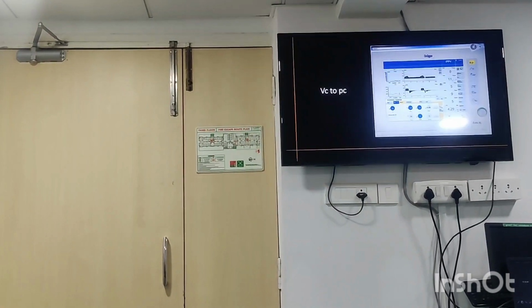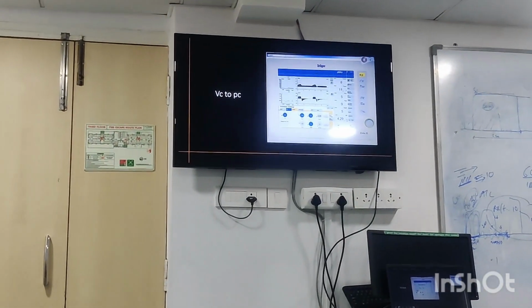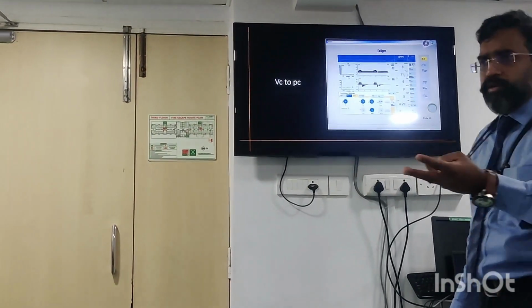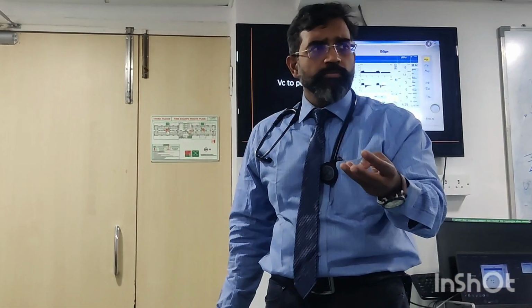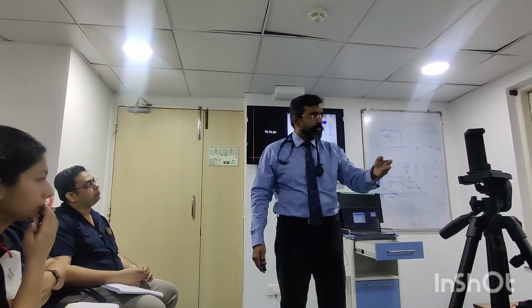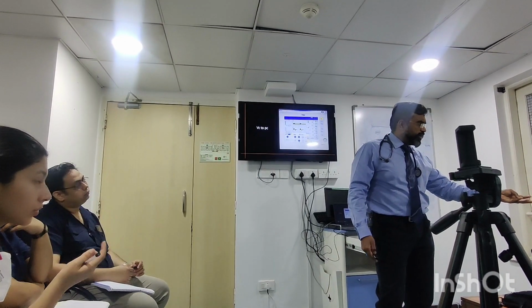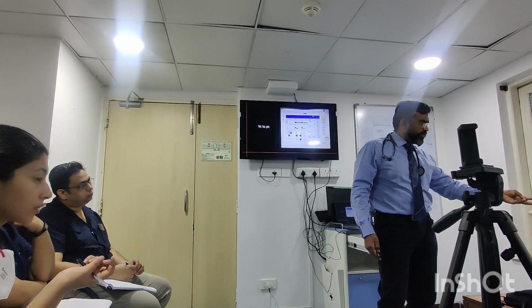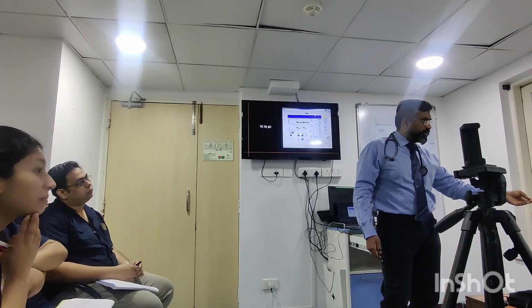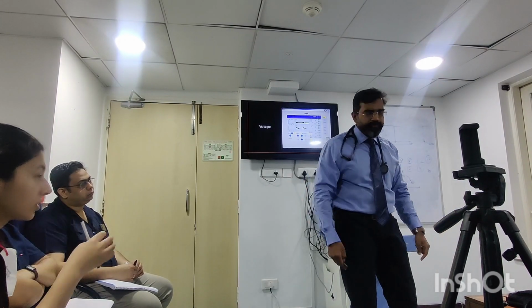Right? Now, I'm going to convert from volume control to pressure control. We discussed what volume control was. What is volume control? Trigger can be patient or machine if it's assist volume control. Limit is volume. Cycling is time. What is a pressure control breath? Patient or machine triggered, can be either of these two. Then limit is the pressure, and cycled by time. And variable is? Variable is volume, whereas in volume control the variable was pressure. Okay, so let's do that.